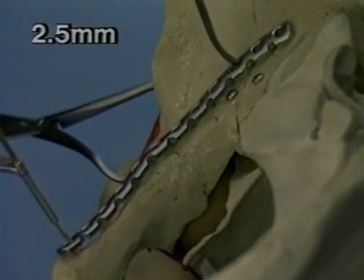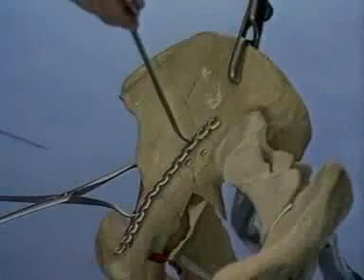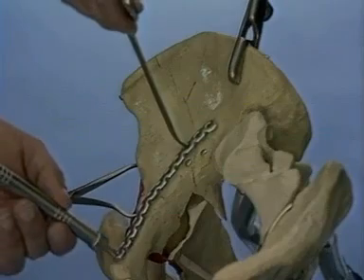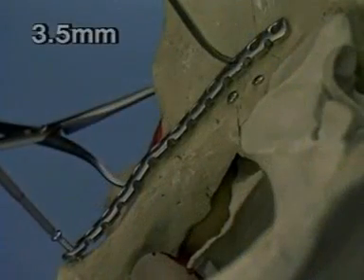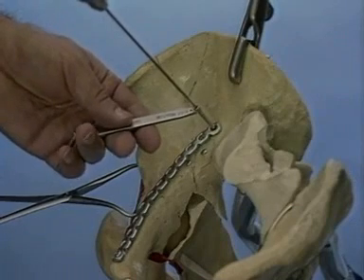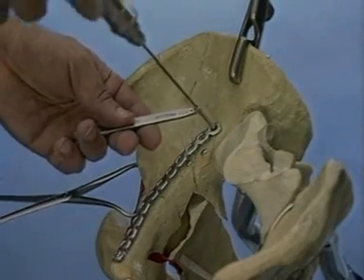A 2.5 mm hole is drilled through the distal plate hole for insertion of the 3.5 mm screw. The depth is measured and the screw is inserted but not fully tightened. When the surgeon is satisfied with the final plate position, a 2.5 mm hole is drilled through the proximal plate hole. The depth is measured and the 3.5 mm screw is inserted and tightened along with the distal screw.